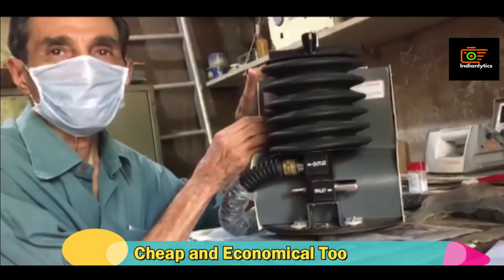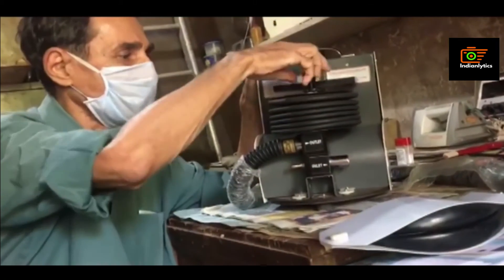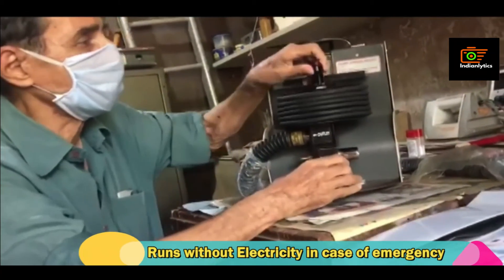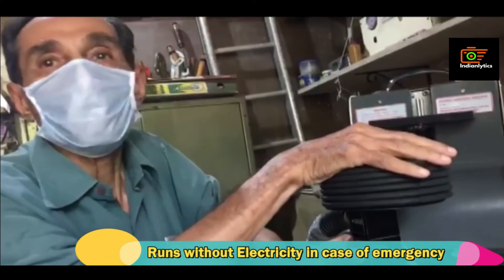In case the power goes off, you loosen this knob and pull this bellows unit out, and you start doing hand inflation.